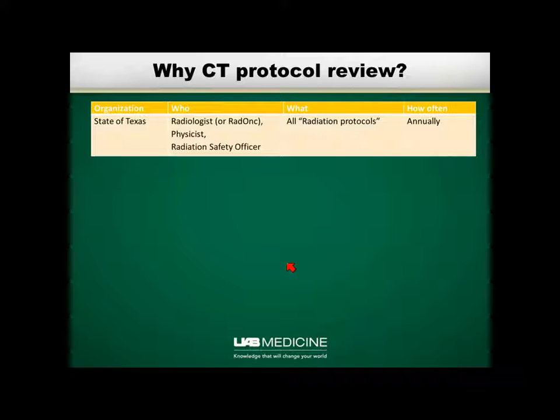The final question is, why do CT protocol review? The final answer is because you gotta. The State of Texas is right now, I believe, the only place in the United States where this is actually required by law. They require that all CT radiation protocols are reviewed annually. If you look into the details of what the law actually states, this means what kind of dose do you expect in this exam, what's your action level, and what are you going to do if a patient goes above that action level.